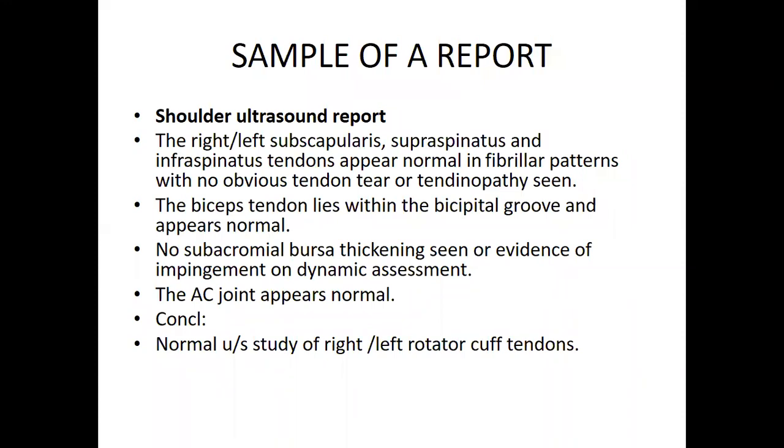But what I wanted to demonstrate on this report is that if you don't see things within your report, you are not going to appreciate them. You're not going to talk about them. So a comprehensive, systematic assessment is very key so that you come and bring them out. I've seen reports maybe where people have talked about things, but they have not demonstrated them.